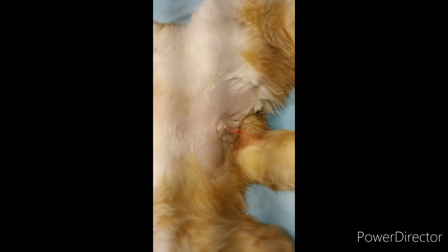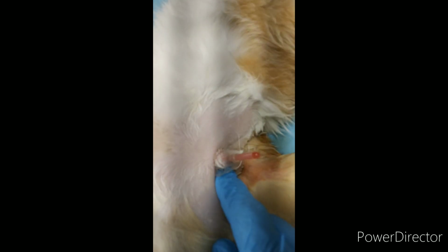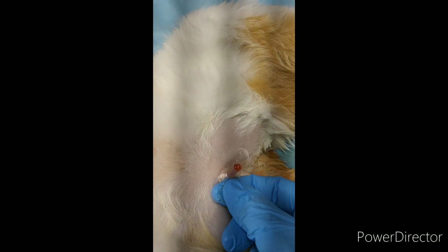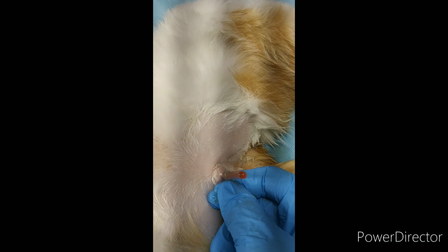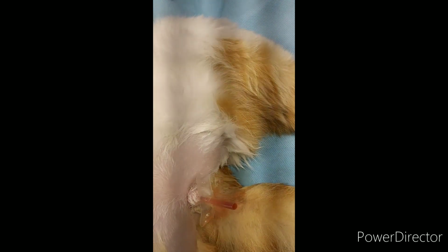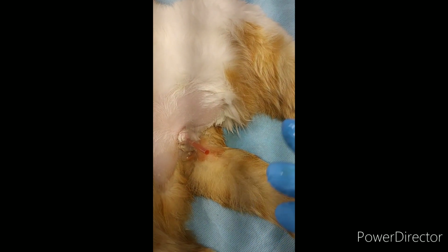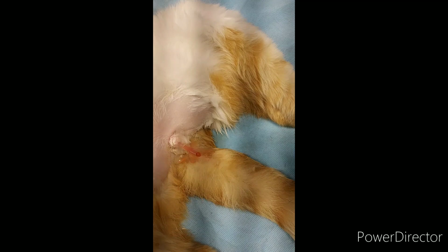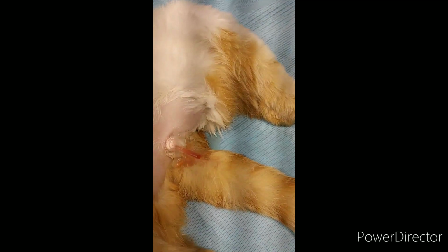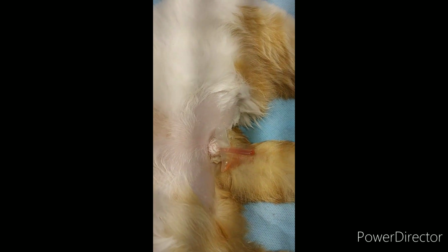Okay, the catheter's in place. I'm going to secure it to each side of this little winged apparatus. And I'm going to flush the bladder till I get clear urine. And I'm going to flush it every day. I'll flush it with 0.45% saline or sterile water.